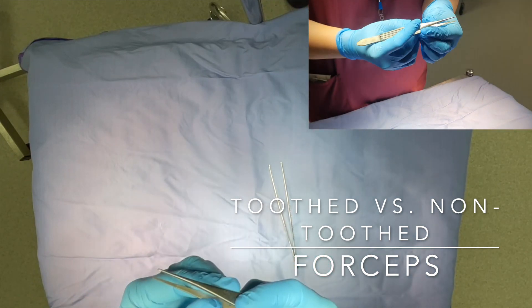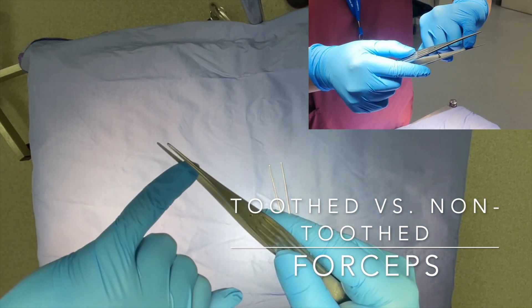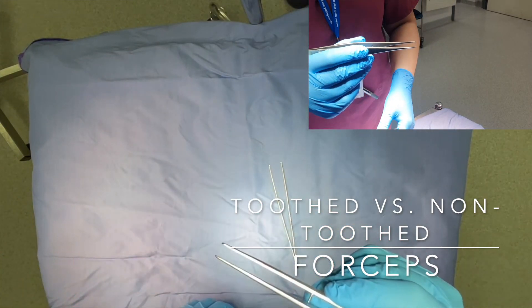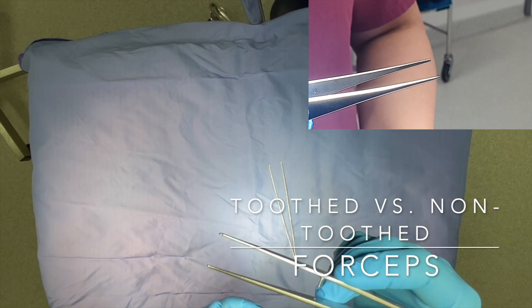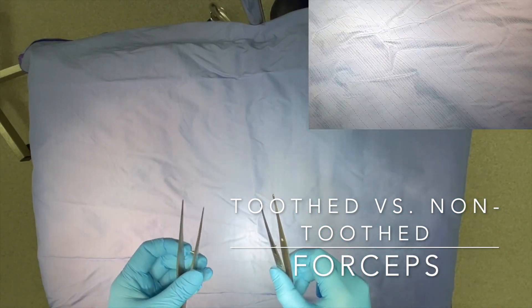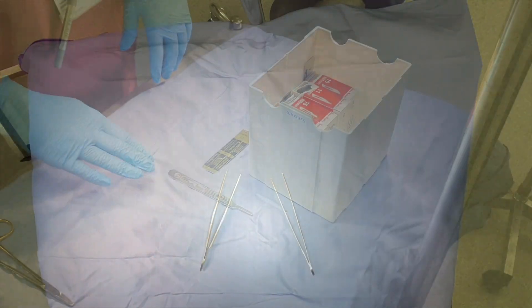This is a non-traumatic, non-toothed DeBakey's forceps, used to handle less robust structures such as bowel, but gently so as not to crush the tissue being held. The correct way to hold them is between the thumb and the forefinger, as demonstrated here. Forceps are also used in suturing to place and adjust the needle in the needle holder without directly handling it.